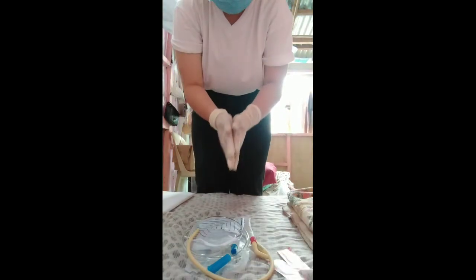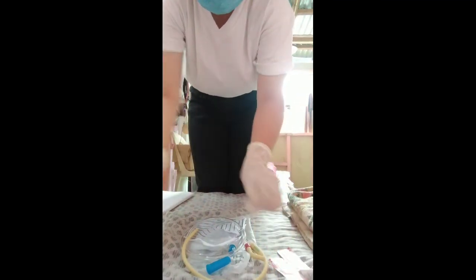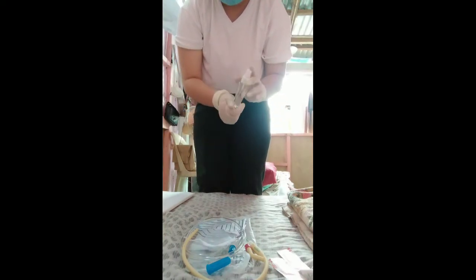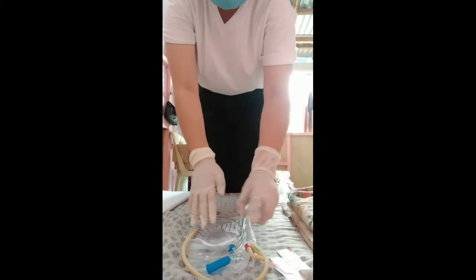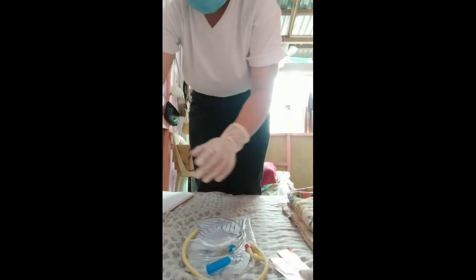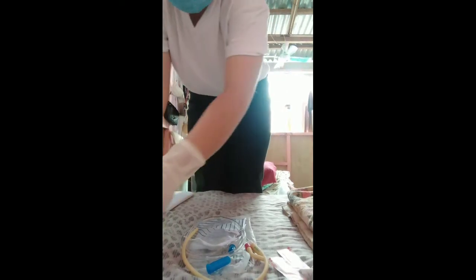So after putting the 10 cc syringe into the port of the catheter, we need to lubricate the catheter. So we assume that this is the lubricant. So here, and we have an alcohol swab for the antiseptic solution.